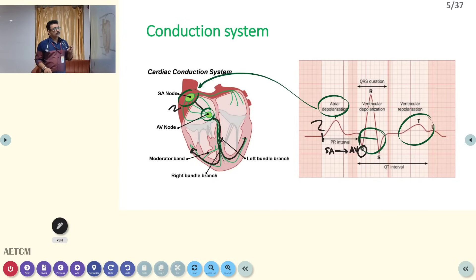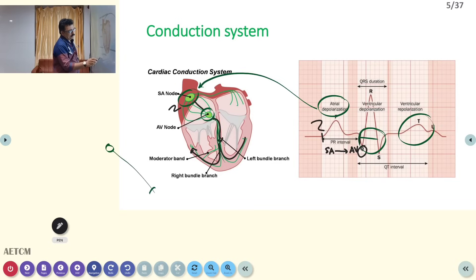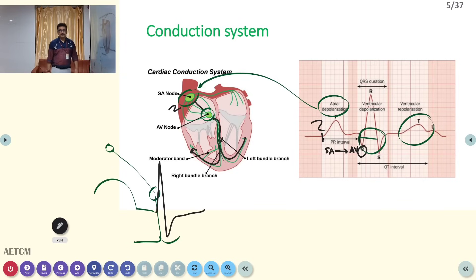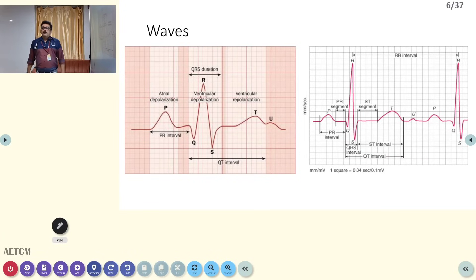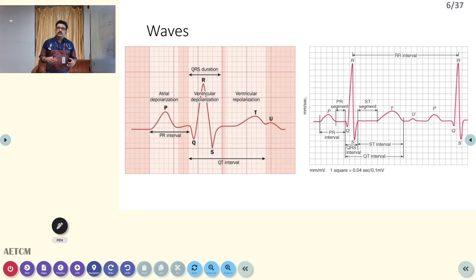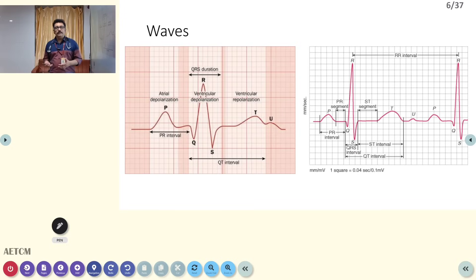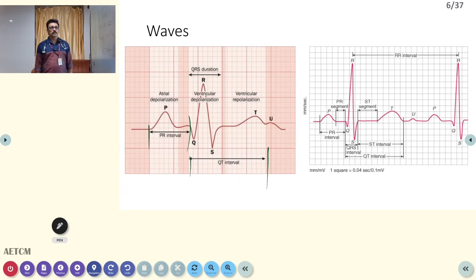Current starts in the SA node, travels to the AV node, then to the bundle, forming the P wave, PR interval, and QRS complex in the ventricle. Waves in the ECG include P wave, R wave, T wave, and U wave. P wave is produced by atrial depolarization, QRS by ventricular depolarization, and the ST segment and T wave by ventricular repolarization. The PR interval is from onset of P to onset of QRS; the QT interval is from Q to T wave.